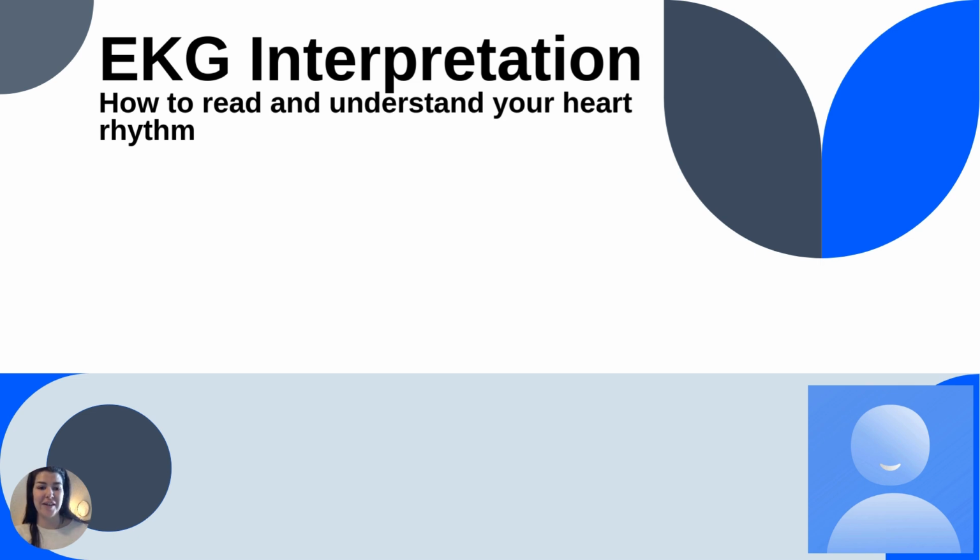Hi, my name is Bianca, and I was wondering if you've ever been to get an MRI done or an EKG, which is also known as an electrocardiogram, a picture of your heart. Today I'm going to be showing you a little bit of what the doctors see behind the scenes when you go and get that done.